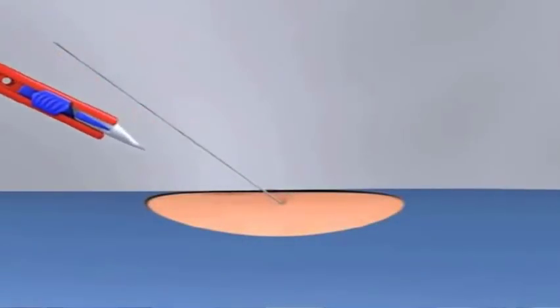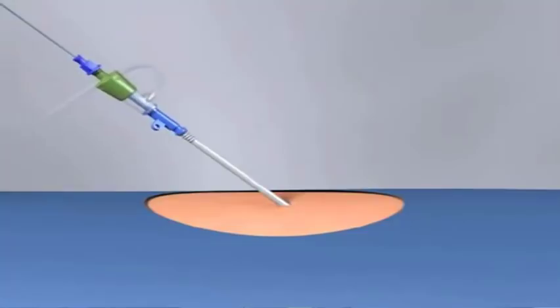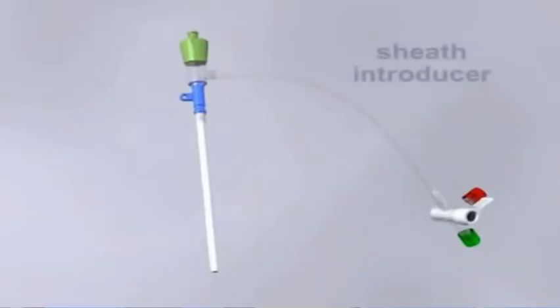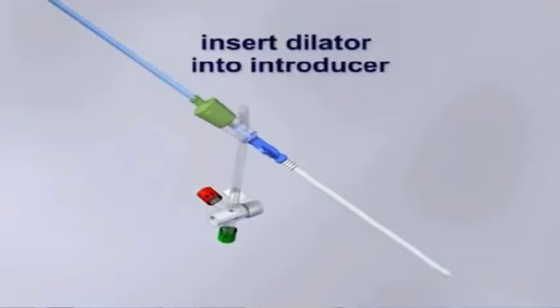But in the sheath introducer, what we do is that we put the dilator into the catheter. We put the dilator here. You understand my point? Then both the dilator as well as the catheter are passed over the guide wire. You got my point?